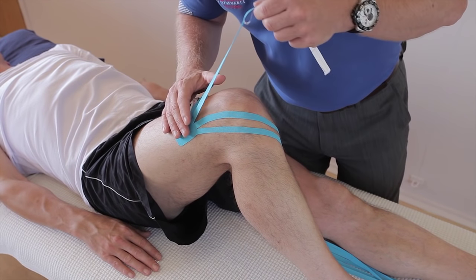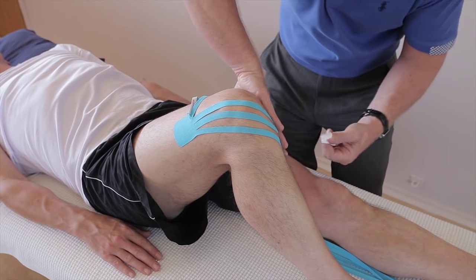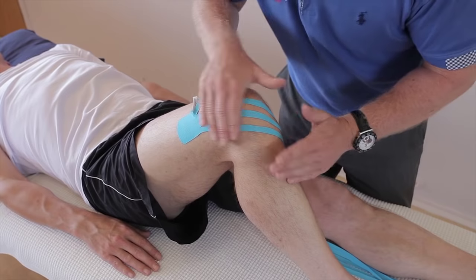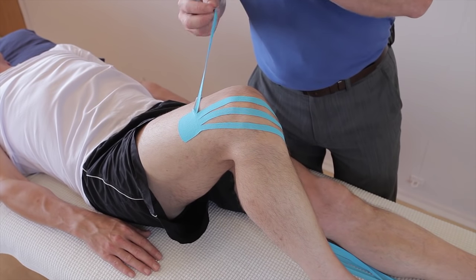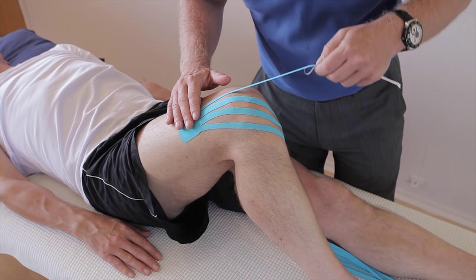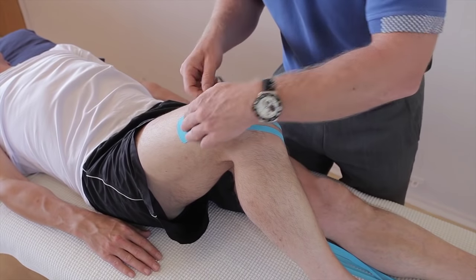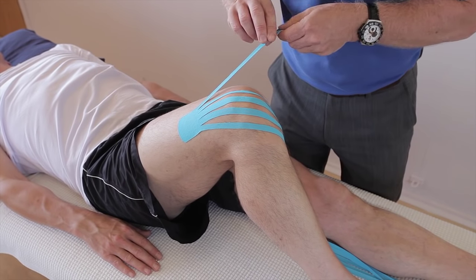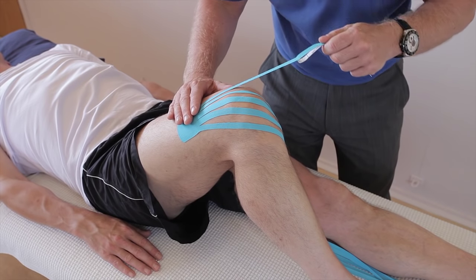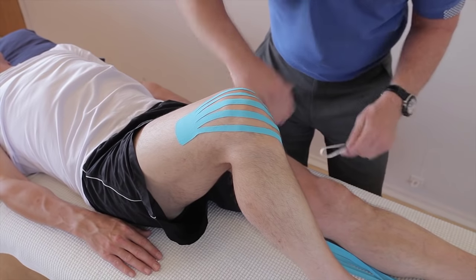We can use the standard way of ice and compression bandage. We can apply ice directly over this tape because it's waterproof, but I'd probably suggest icing only rather than applying a compression bandage, so we have the full effect of this tape. You'd be amazed how quickly this would actually work to reduce the swelling. So that's the first application.